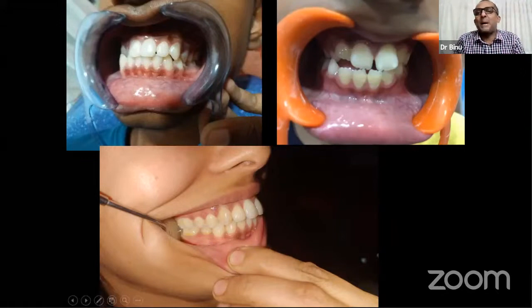But one more thing I want to comment about this. This doctor used a cheek retractor, which I think the doctor has been using right from the day the clinic was inaugurated. And that cheek retractor is being used for all the composite works, all the bracketing works, everything. So it's dirty, it's scratched. Have a separate 100 rupee cheek retractor, separate, clear, transparent, nice ones. 100 rupee exclusively for photography. All I've told you to invest today, tonight, at this point of time, is a 100 rupee cheek retractor. That's all. More investments are going to come, but I'm telling you, it's cheap. It's not that bad. I'm not that costly.